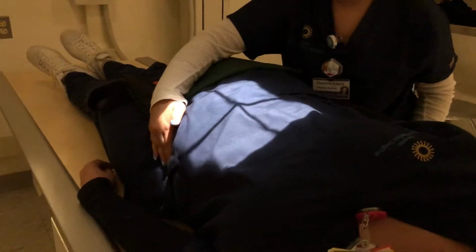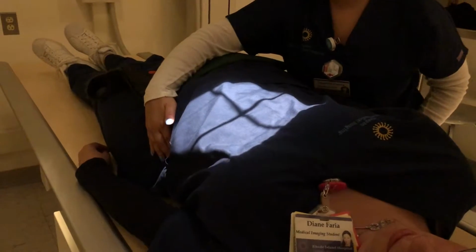Basically, we're worried about the duodenal bulb, and we're trying to get that away from the spine. Okay, so we're going to center, this is a sthenic type patient, so we're going to center at L1-2. So we'll put the bottom of the IR at the iliac crest. We don't really need any light on the table at all. So we can collimate down to a 10 by 12.